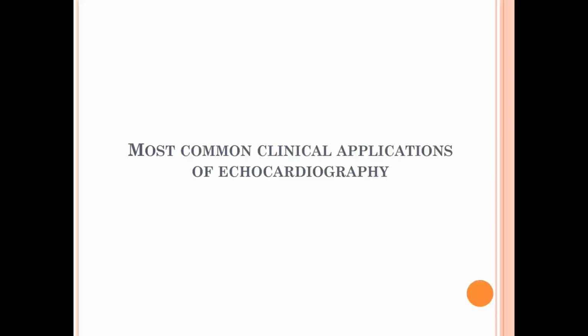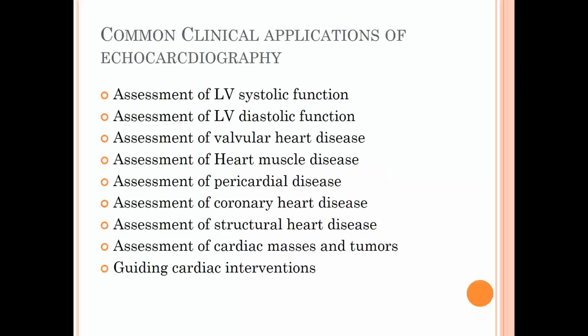What are the most common clinical applications of echocardiography? It is used in the assessment of left ventricular systolic function, left ventricular diastolic function, valvular heart disease, heart muscle disease of all kinds, assessment of pericardial disease, coronary heart disease, assessment of structural heart disease, cardiac masses and tumors, and finally, and most importantly, to guide cardiac interventions.